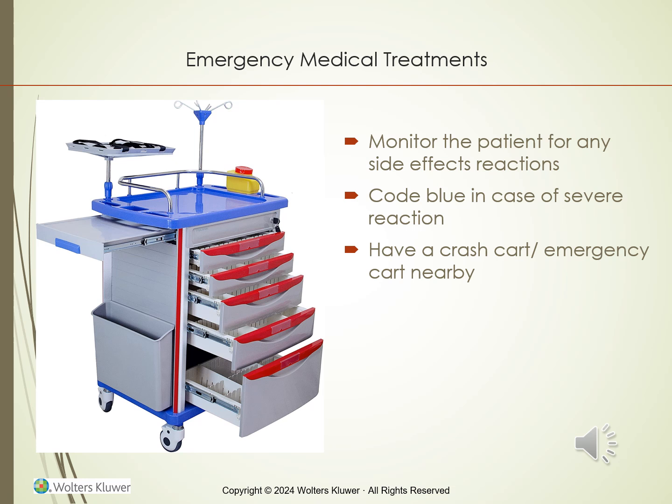An emergency cart, also called a crash cart, is a mobile set of drawers like seen on this slide, as well as trays designed for rapid deployment in emergencies. While contents may vary by location, imaging department carts typically include items for managing cardiac as well as respiratory arrest due to contrast media reactions.